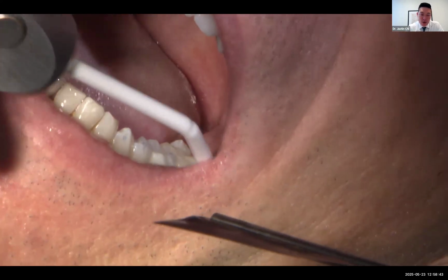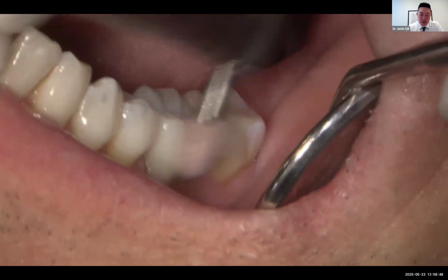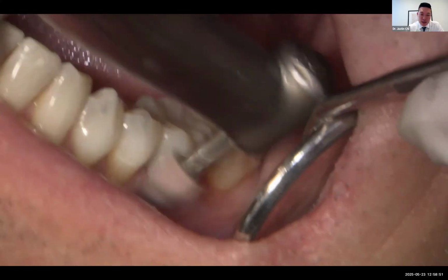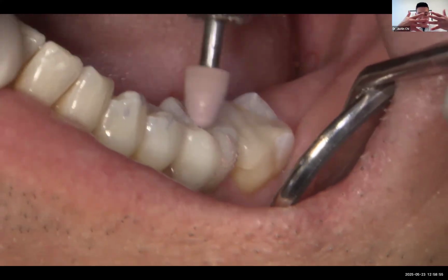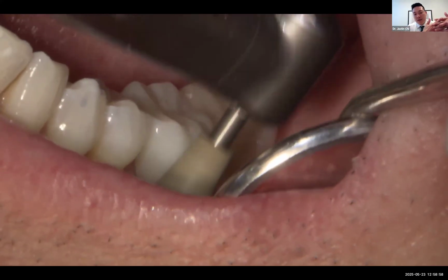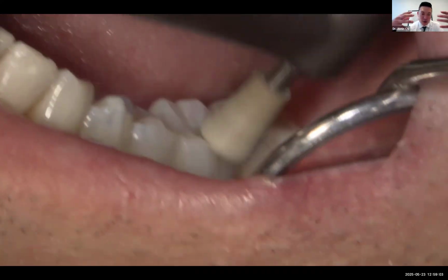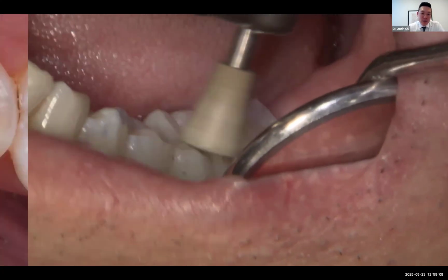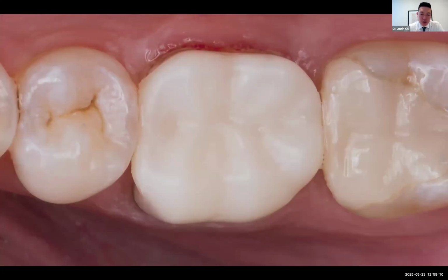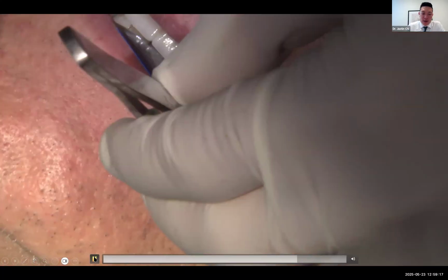Because of the more non-traditional, non-retentive situation. When we bond, a term that's often used in the bonding and adhesive dentistry space is a monoblock formation. We're relying on micromechanical retention, and for forces applied on the restoration, it serves as a single unit. That's what we're hoping to achieve through a sound bonding protocol, good adaptation of our restoration to the prep. After we bonded everything in, I was using the polishing kit.